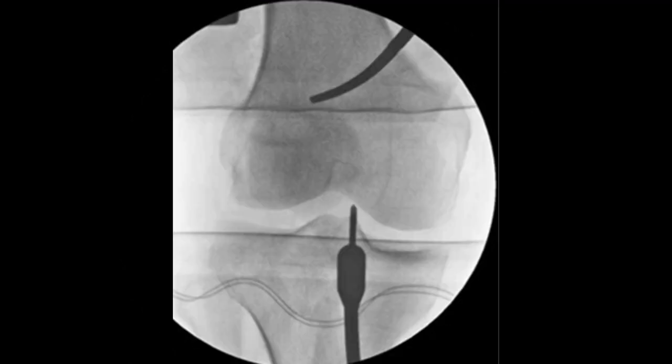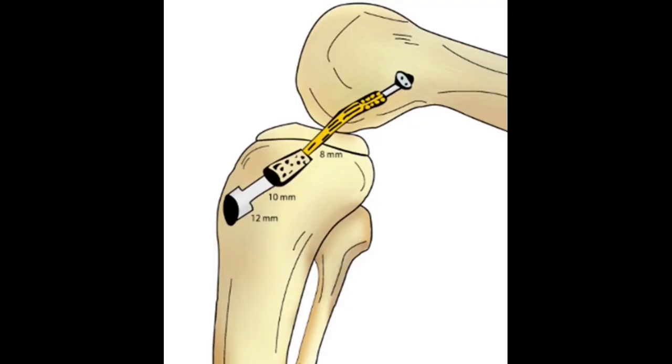After that, the tunnel is expanded with a 10 mm dilator over the guide pin to within 3 to 4 mm of the tibial articular surface. The tibial cortex is reamed for approximately 5 mm length with a 12 mm diameter reamer so that the broad edge of the bony end of the graft can pass through the tibial cortex.